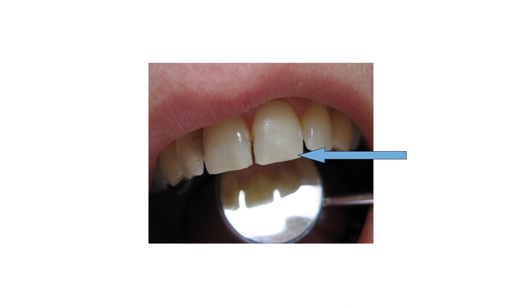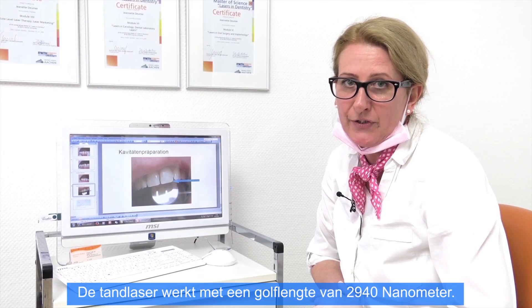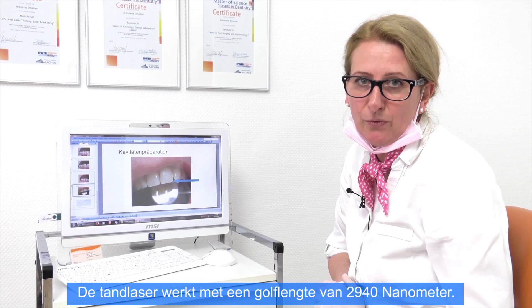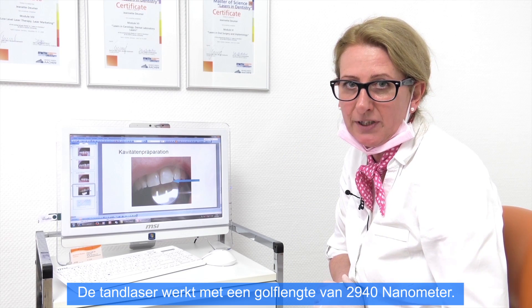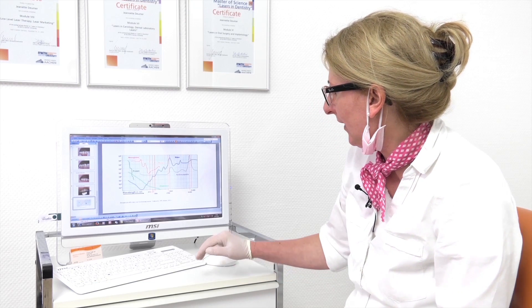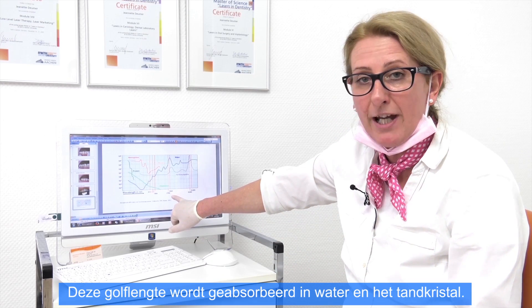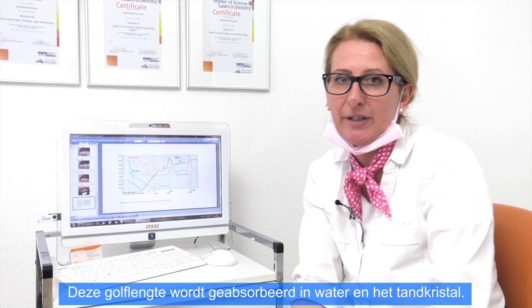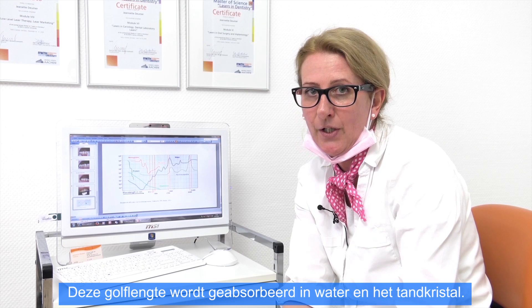The laser works with a wavelength of 2940 nanometers, and the absorption for this wavelength is in water and in hydroxylapatite crystals. Now let's start and have a look at how it works.